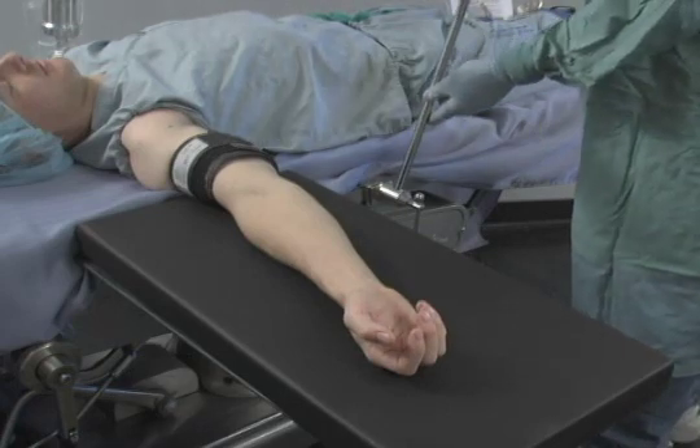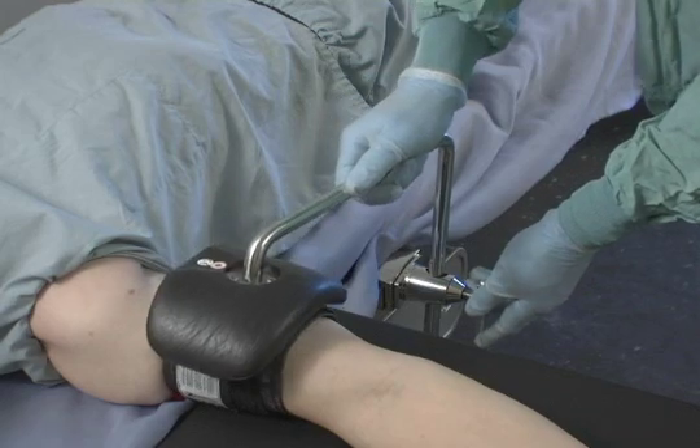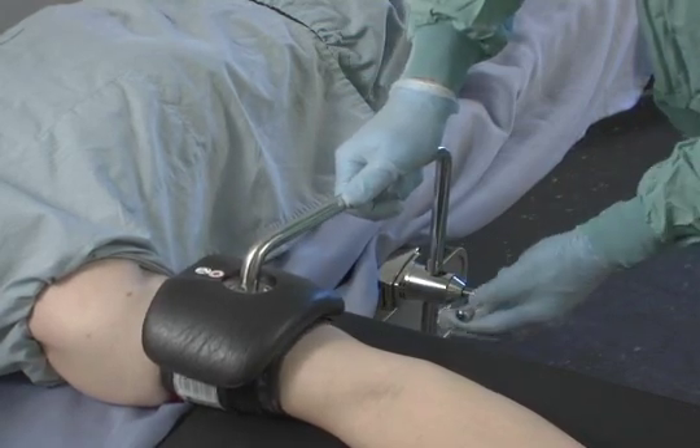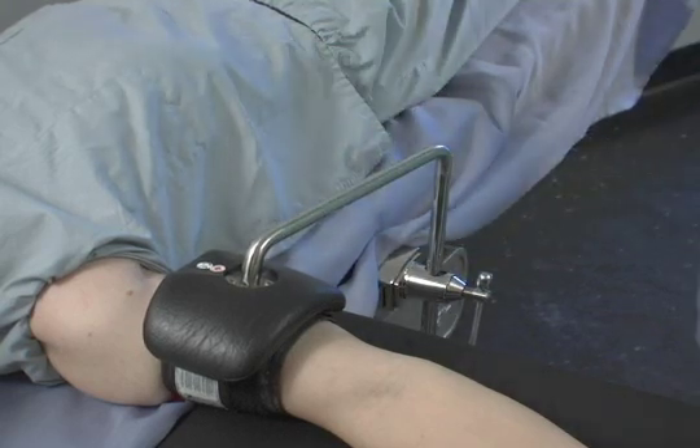The bicep counter traction post is positioned over the patient's bicep. The post fits into a Clark clamp and the pad goes over the patient's bicep, or over the tourniquet if used. Ensure that the tourniquet air outlets are turned to the side and not directly under the pad.